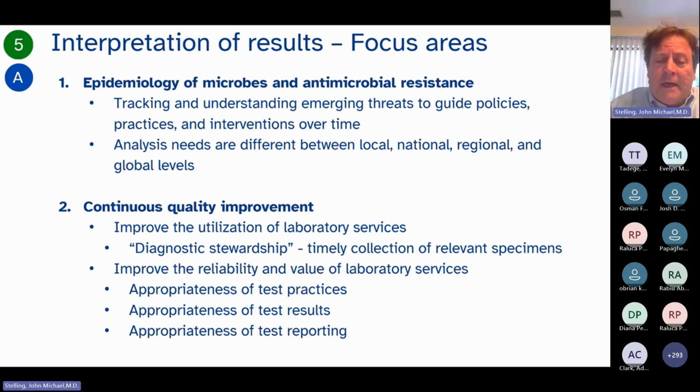Are the drugs correct? Are there contaminations? Are there strange results? And also diagnostic stewardship. Everyone is familiar with the concept of antimicrobial stewardship, the appropriate use of antimicrobials. Diagnostic stewardship is the appropriate use of diagnostic services.